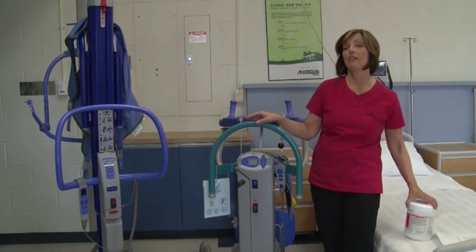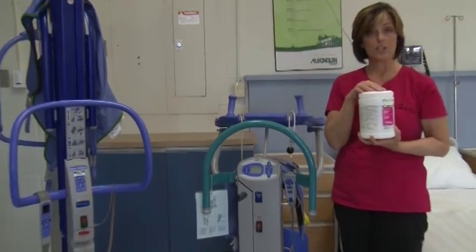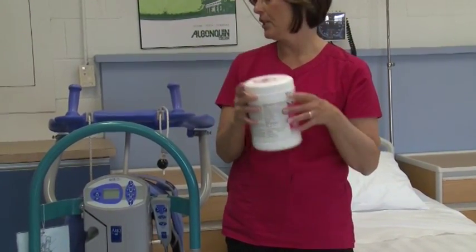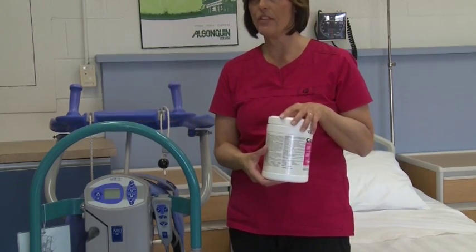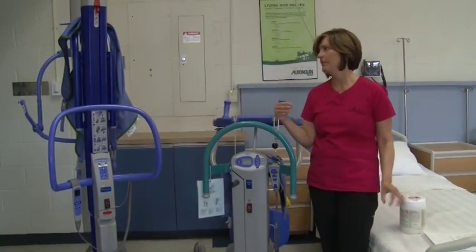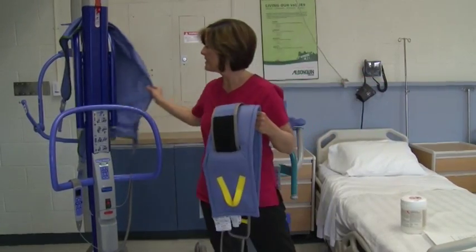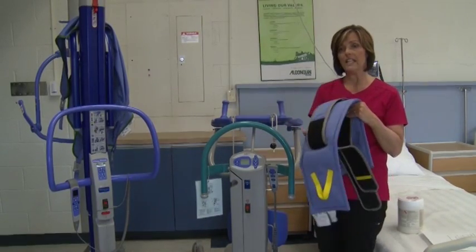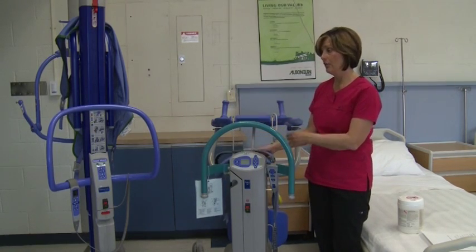After each use of a mechanical lift, it's important to clean the lift using disinfectant wipes, as per the agency protocol, identifying what type of wipe to use. It's best to clean the lift immediately following the transfer of a client. Then it is for sure clean for the next client. In terms of the straps or the slings, the canvases, most of the time they are cleaned only when they are soiled, and again that would be as per the agency protocol and as per the manufacturer's instruction.